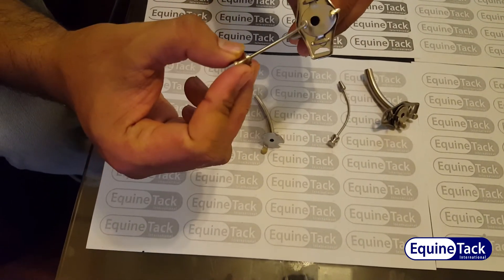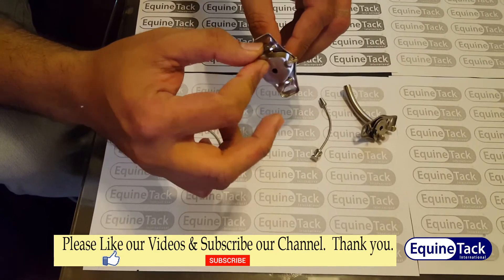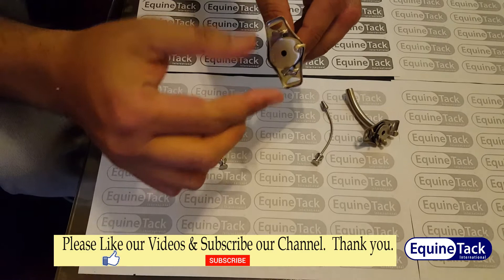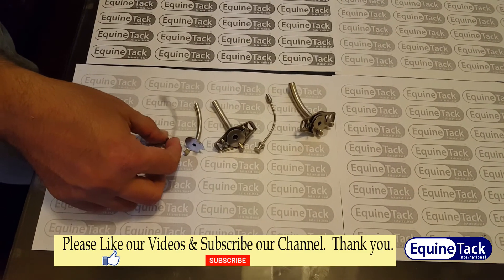This is the obturator to remove the blockage, as you can see. We are manufacturing in brass as well as in non-magnetic steel, very safe for human use. Please let us know your requirement. Thank you very much for watching.